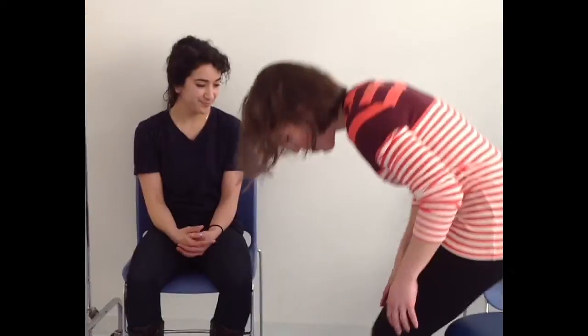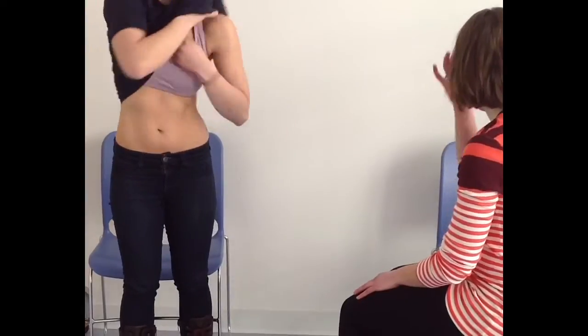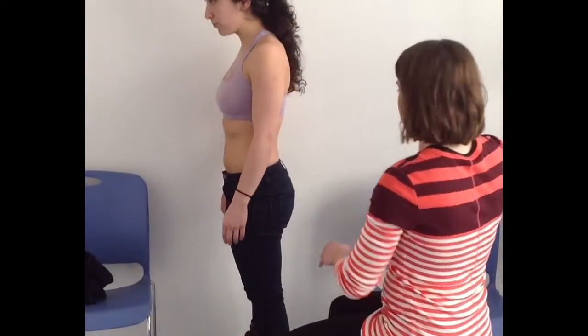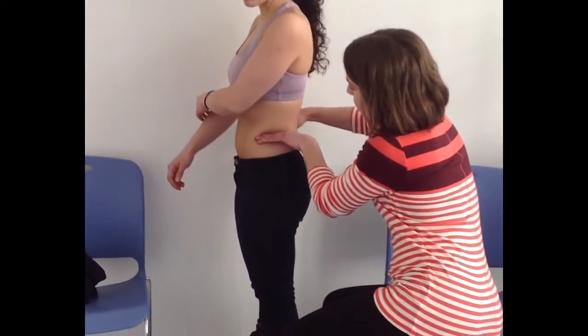Hi, Ina. My name is Nicole Harmon, and I'm going to be your physical therapist today. Nice to meet you. So today I just want to look at your back motion. So if you could stand up and take your shirt off for me. Okay. And just go ahead and stand right here, turn to the side. Alright, so I'm just going to feel for a few landmarks right now.